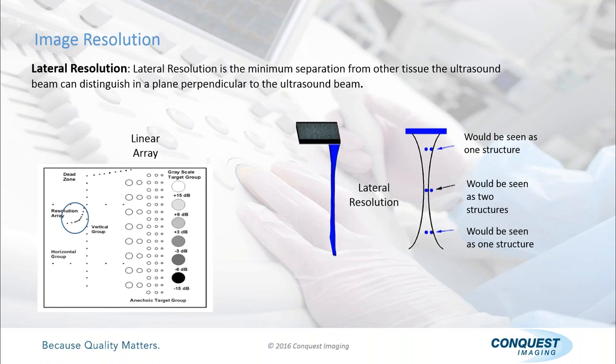Let's talk lateral resolution. In this case, we've got the same blue dots, except now lateral means perpendicular to the ultrasound beam, or side by side. I always remembered lateral when I was new because it started with an L and that was left to right. So that was how I differentiated axial versus lateral. Lateral: side by side, or left to right.